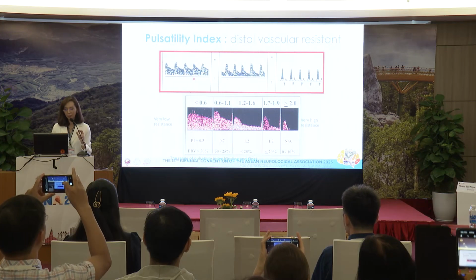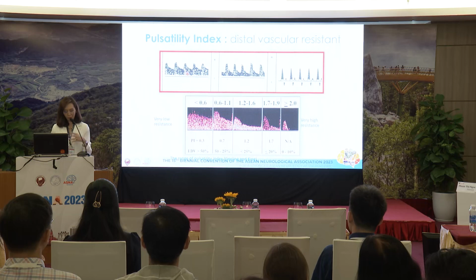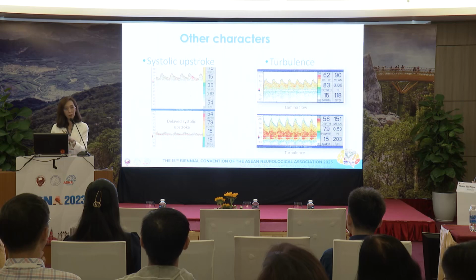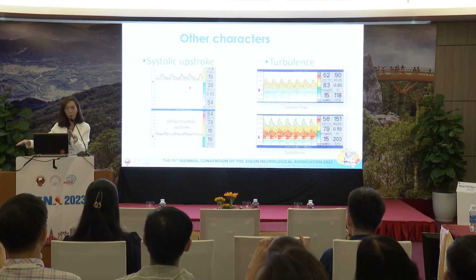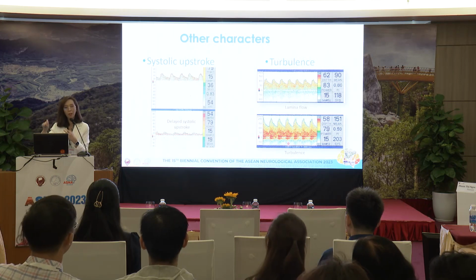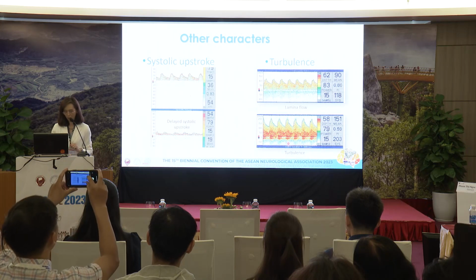So for intracranial vessels, we are looking at the low resistant circulation. So it's very likely that it's going to be in this range, and it usually looks like this for the intracranial vessels. There are some other characteristics you have to look at in the waveform, the systolic upstroke. Sometimes you have a dampened waveform, meaning that you are at the distal part of the stenosis. Or sometimes there's some turbulence. When there's a stenosis, there's turbulent flow, so you can hear the murmur or some turbulence noise over the area.